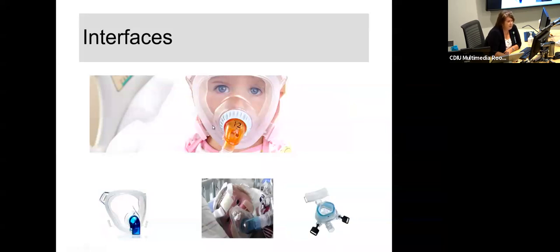Any of those kinds of things that you can use to convince a child to put a mask on their face is always a good thing. So if you need to wear one, or you need to put stickers on your own demo mask, then go ahead and try that. It is a bit of a challenge to try to get a 2-year-old to wear a non-invasive mask. It is incredibly labor intensive.